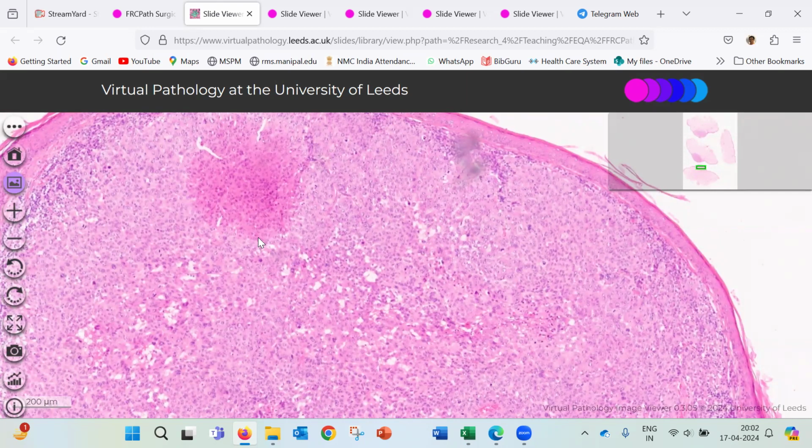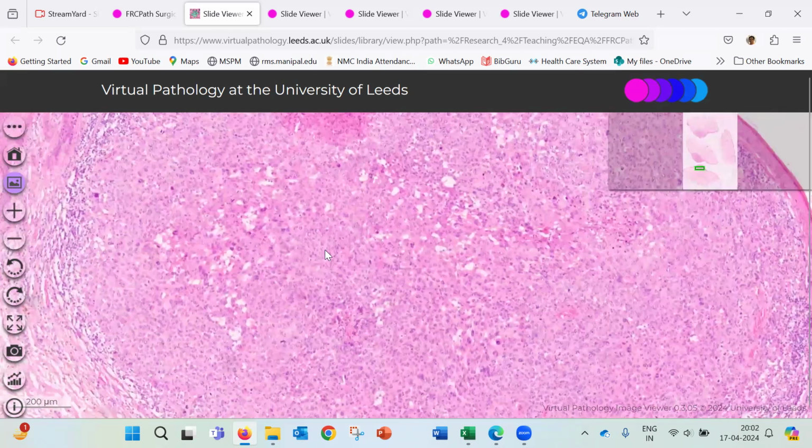And sometimes you may think of a poorly differentiated histiocytic or hematolymphoid neoplasm also, but you should keep a broad differential with melanoma favored in it. Once that is done, the usual broad markers are cytokeratin, that is pan CK, LCA, S100, and SOX10. These are the broad general lineage markers you should do.